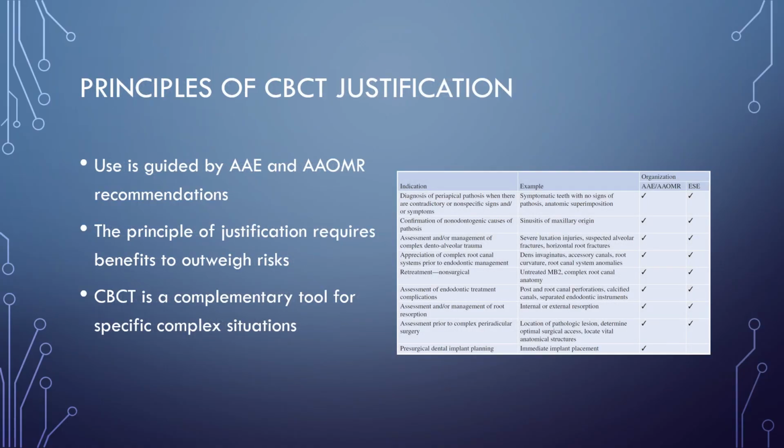Despite its incredible diagnostic power, the decision to prescribe a CBCT scan must never be taken lightly. Its use in endodontics is strictly guided by joint position statements from the AAE and the AAOMR, which emphasize the fundamental principle of justification. This means that for every single patient, the clinician is responsible for weighing the potential diagnostic benefits of the scan against the potential risks of additional radiation exposure.